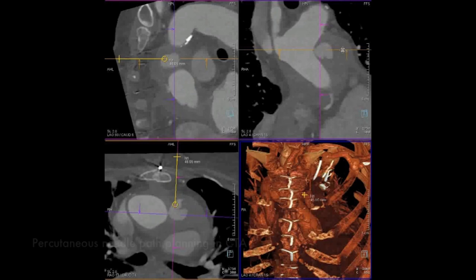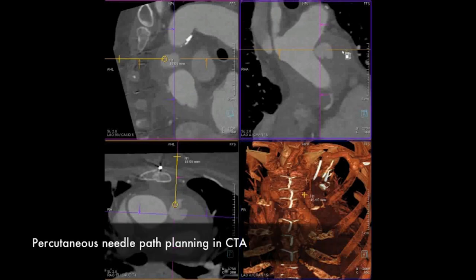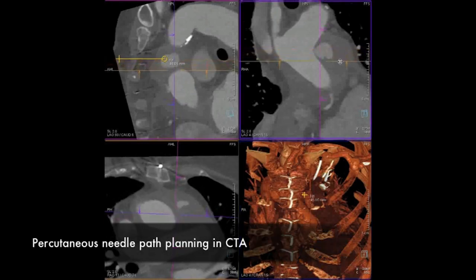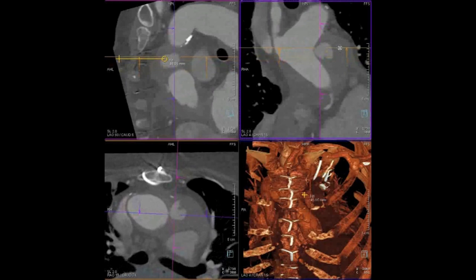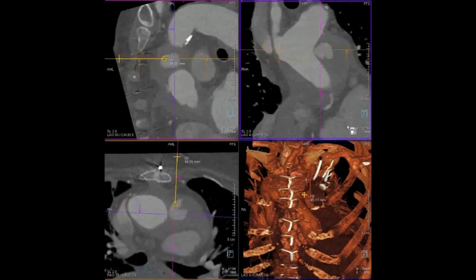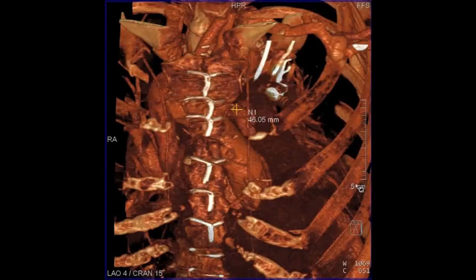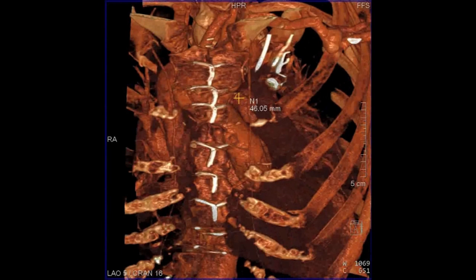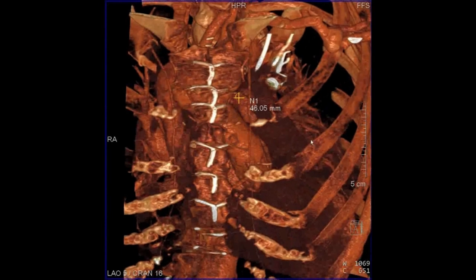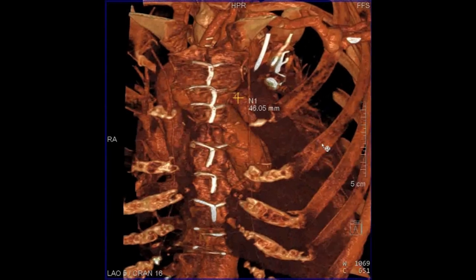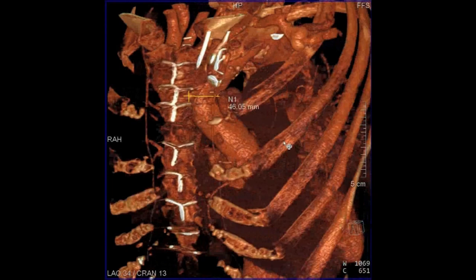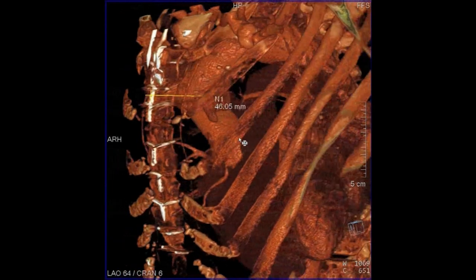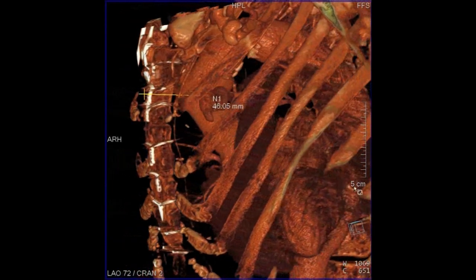We took her back to a hybrid operating room. The plan was to re-attempt embolization, and if that failed, to immediately go to sternotomy and cardiopulmonary bypass for repair. Because of the earlier futility in trying to catheterize this from an endovascular standpoint, we decided to approach it directly using a transsternal percutaneous puncture.